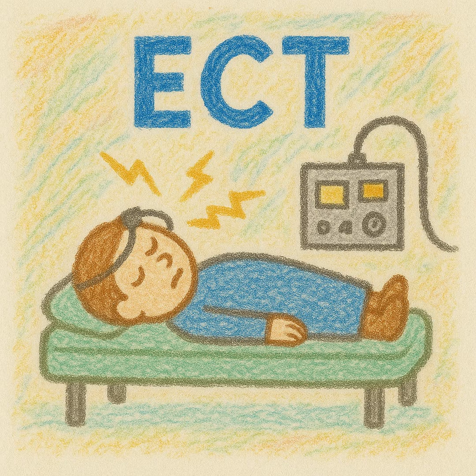Okay, so you do the ECT consultation, you decide that they're low risk, you get informed consent. So then you schedule the first ECT. On the first ECT, the patient's going to show up, they'll get checked in through registration, they'll get assigned a room in a PACU, a peri-anesthesia care unit, pre or post-anesthesia care unit. And the nurse will check them in. They'll probably ask them some questions. The nurse will probably administer a PHQ-9 or GAD-7 and things like that. The nurse will put in the intravenous line.